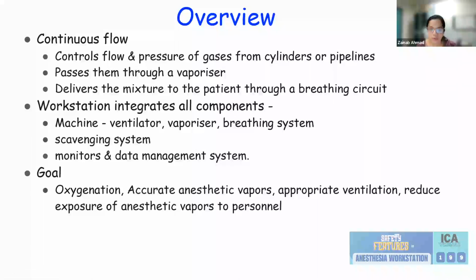We know that a workstation integrates each and every component. So you don't have anything that is separate from the workstation. We have the anesthesia machine, that is the main part of the machine which delivers the anesthetic agent per se, the ventilator, the vaporizer, the breathing system, the scavenging system, the monitors and the data managing system. So everything is integrated into one single unit. So you don't have different connections. There's less possibility of misconnections. And there are a lot of other advantages of workstation.